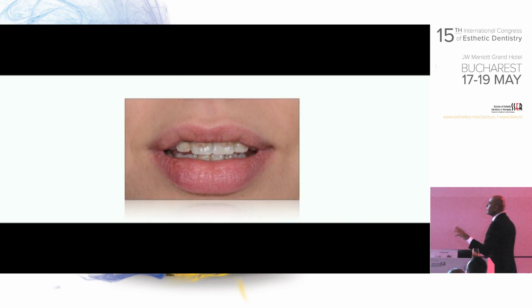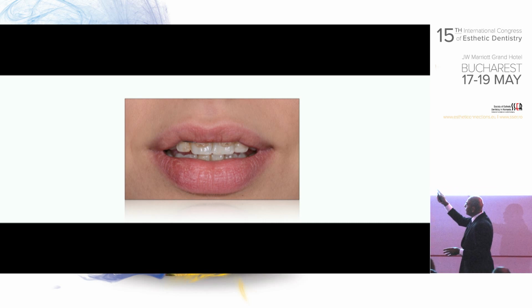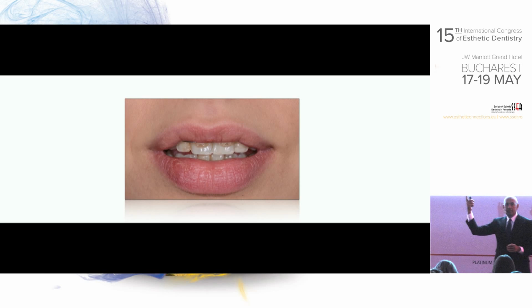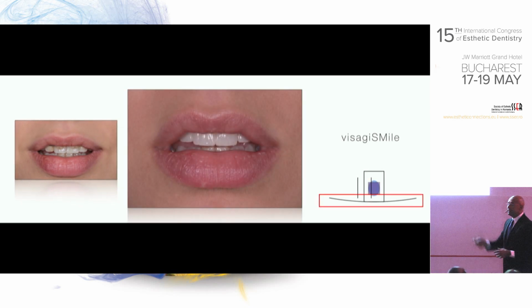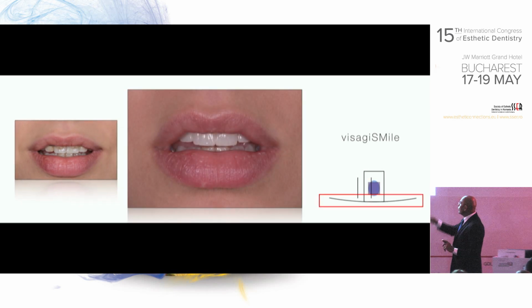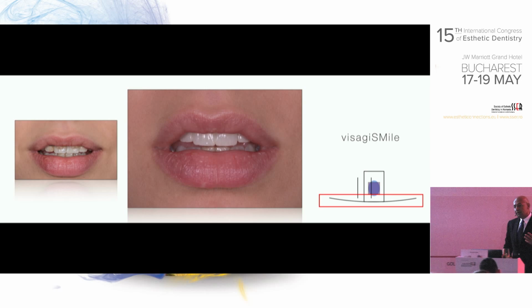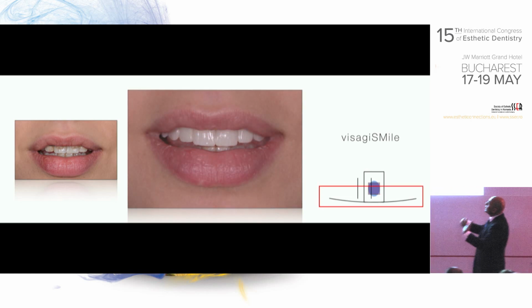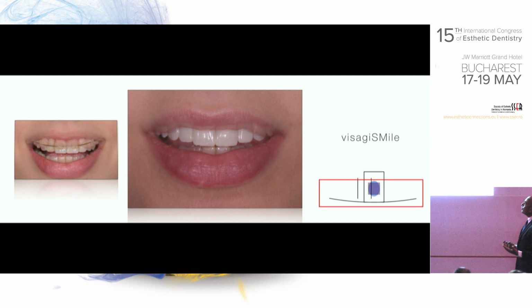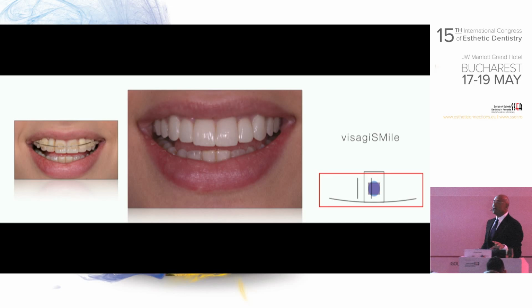And then let's see the comparison between how we started and where we are now. So this is the flowable I placed in the patient's mouth on day 1 with the braces. And this is what we ended up with after the porcelain. Now, because they are both mimicking what we had as the Visage Smile design, this is exactly how we ended up. The biggest difference is that now, the more the patient starts smiling and the lip line goes up, the more beautiful it looks compared to where we started when the patient had braces.